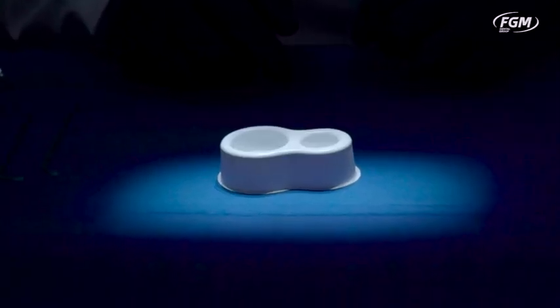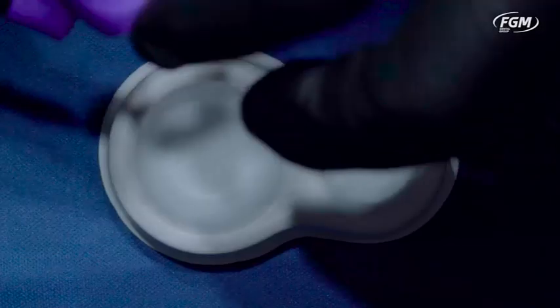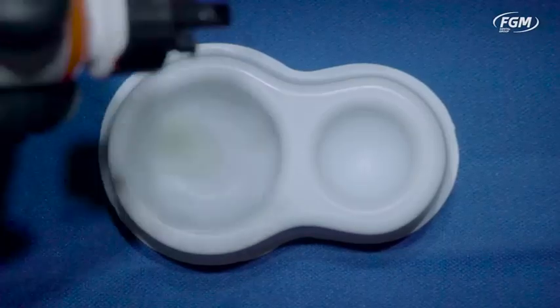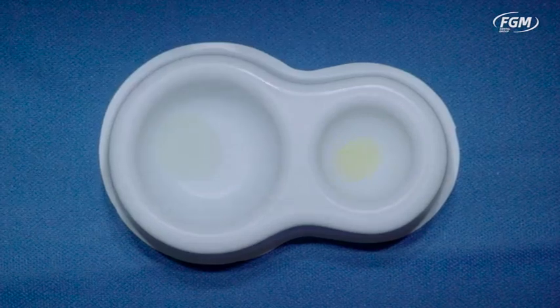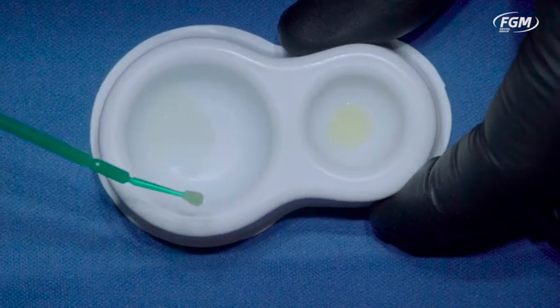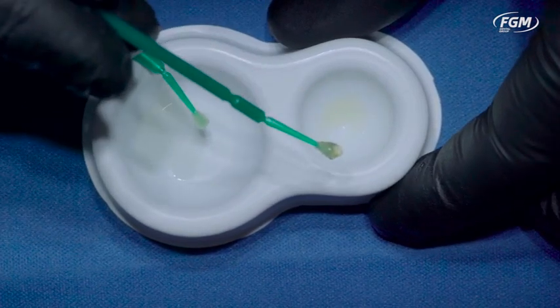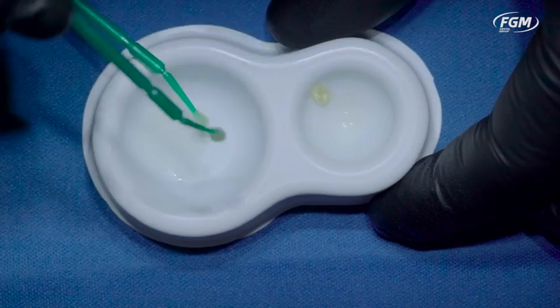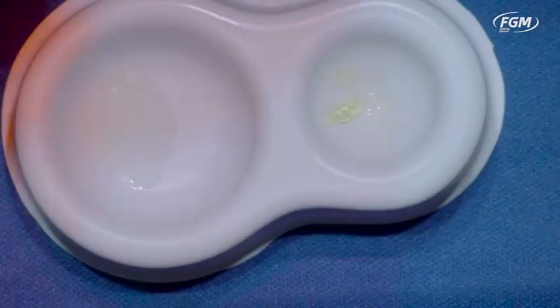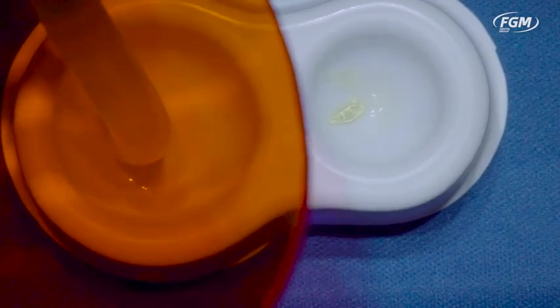Now we're going to demonstrate the effect of APS technology on the color of adhesives. We'll add a drop of APS adhesive and a drop of another well-known adhesive on our dispensing well. As you may see, one has a transparent color and the other one has quite a yellowish appearance. We're going to zap it with the light, and even after curing you'll see there's quite a difference — meaning a transparent adhesive is more beneficial when you're doing aesthetic dentistry.